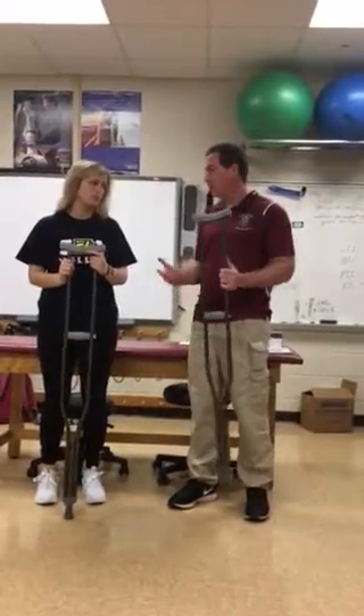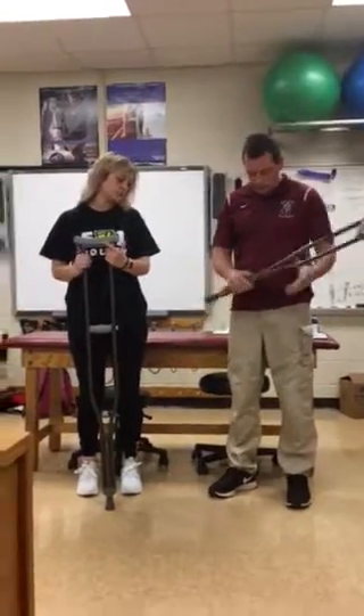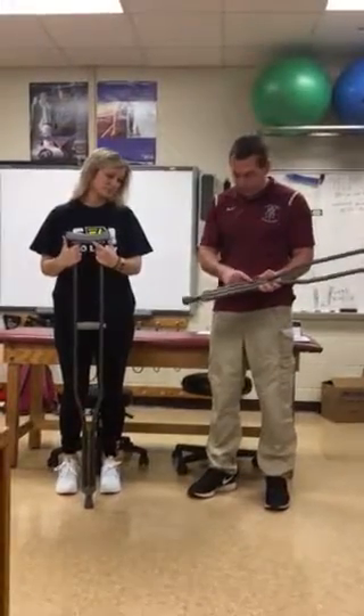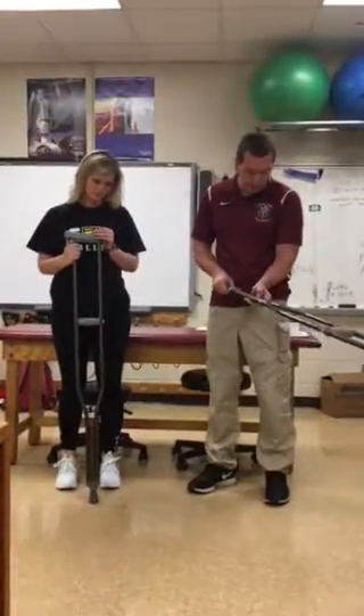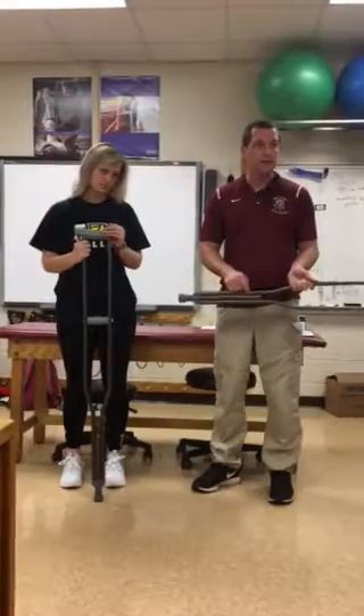First thing you're going to do is ask the athlete how tall they are. How tall are you? 5'10". These crutches range from 5'10" to 6'6". So I'm going to push in on this little button and push up on the bottom of the crutch and move it to the 5'10" setting.